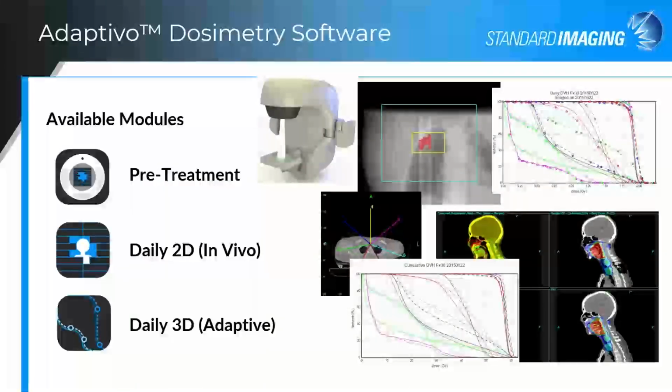So like I'd mentioned, there are 3 modules in Adaptivo. We do have a pre-treatment module for doing pre-treatment QA for your IMRT plans, a daily 2D or INVIVO module, and a daily 3D adaptive, which I'll briefly cover in some of the slides here.